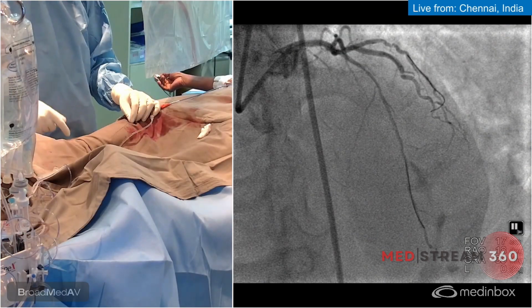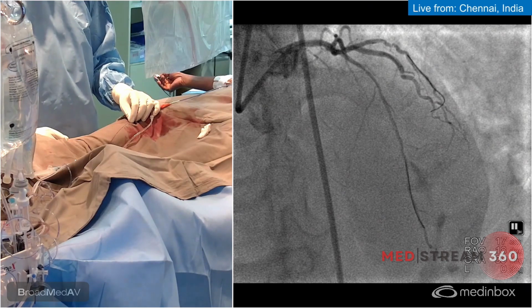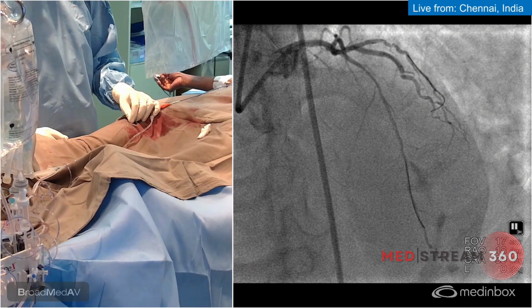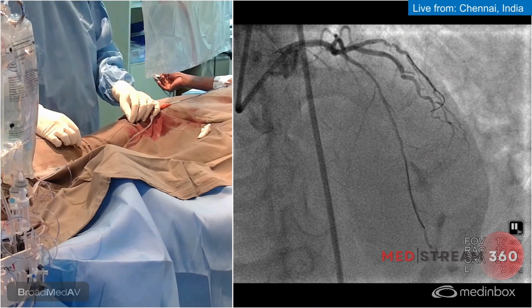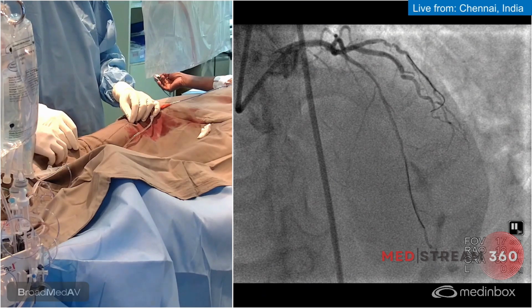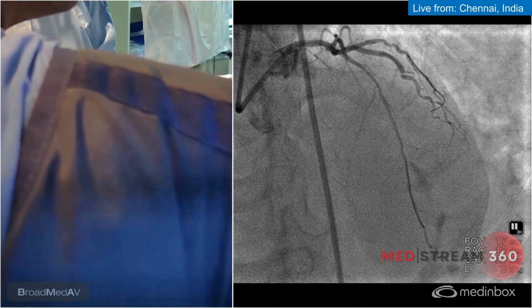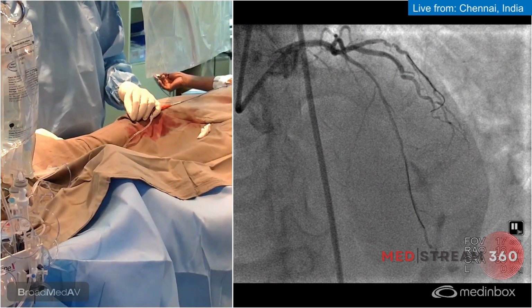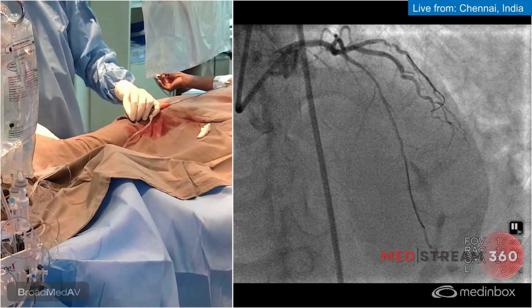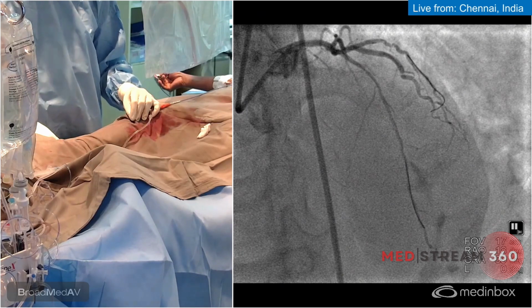The left main is 3.75. Hence, we need to take the next stent, which goes up to 3.75. Yeah, so I think we will measure it after this from the stem to the ostium of the left main, and I think we may use a 3.0, which will go up to 3.75. Okay, so what we're going to put is a 2.25 stent, which is 22, which will cover from maybe about 10 millimeters away from the septal backwards, and then use a longer stent with an overlap, which may be about a 30, I think.